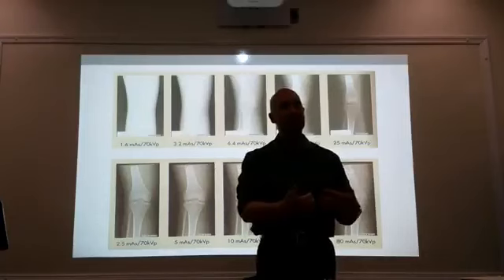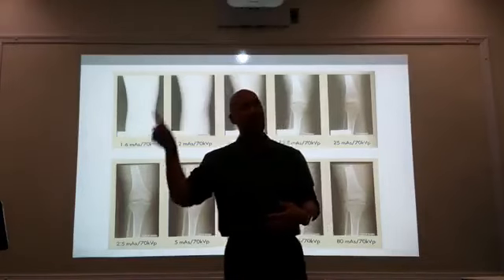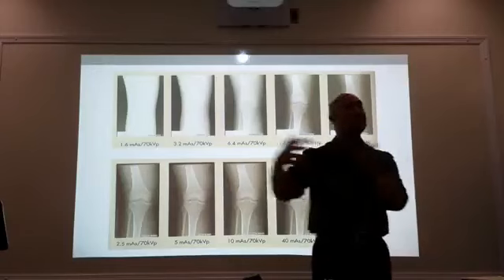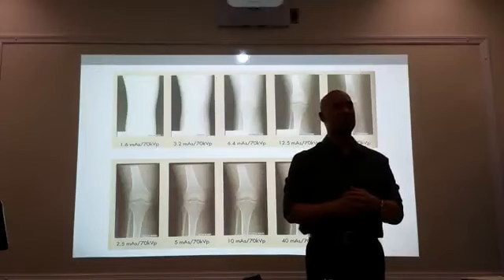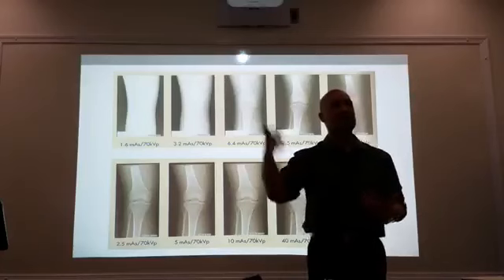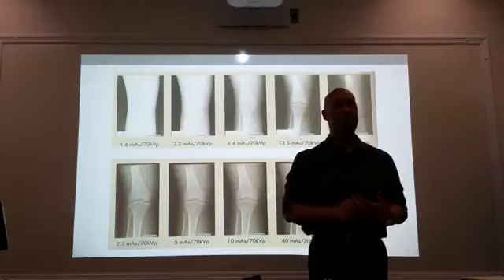But the technical factors there could be set up for a chest x-ray. Now you've got a patient in there for a foot x-ray, and you're using foot techniques on someone who should be a chest x-ray. Do you understand what I'm saying? They get lazy, so they're not checking their technical factors. They're just hitting the button. Okay? We don't want you doing that.